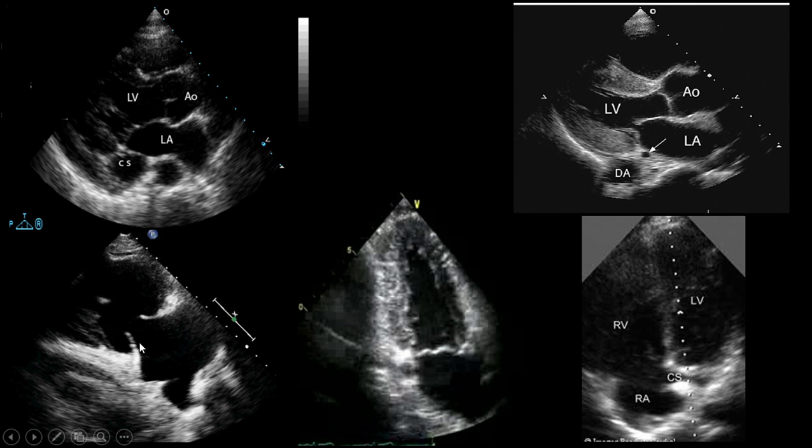One of them is the RVIT view, or tricuspid view, on the PLAX. Here we have the tricuspid valve. This is the septal and posterior leaflet, and this is the anterior leaflet of the tricuspid. Posterior to the posterior leaflet, here is a wedge shape during heart activity. This is the orifice, or entrance, of the coronary sinus to the right atrium, and posterior to that we see a thin hyperechoic line. This is the Eustachian valve, belonging to the IVC.